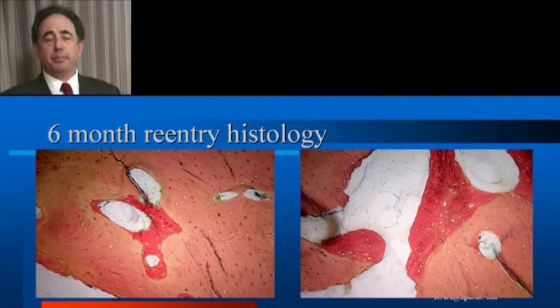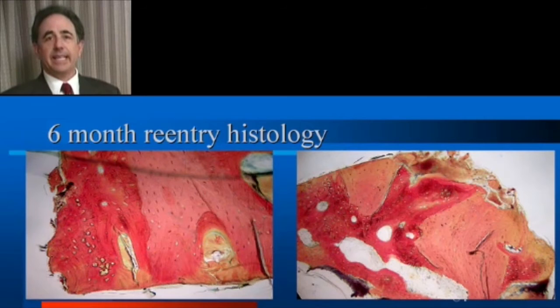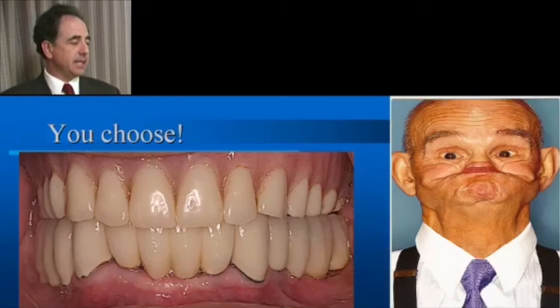Histologically, we see the pinker portions of this graft material are the mineralized alveolar bone chips that are placed in the graft, which decreases shrinkage, but the redder sections of this histology show us new vital bone growing all around these pieces. Again, in this section, we have about 50% residual non-converted bone chips, which will convert over time because we have seen osteoclasts on this material, and we see approximately 30 to 40% new vital bone forming in this site.